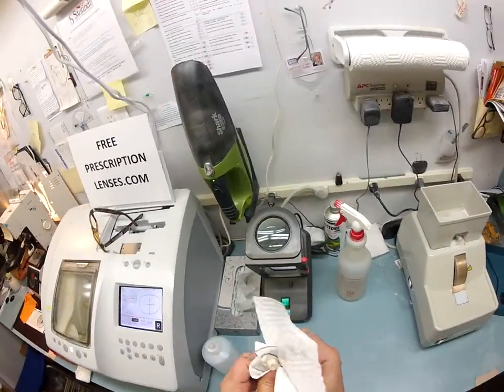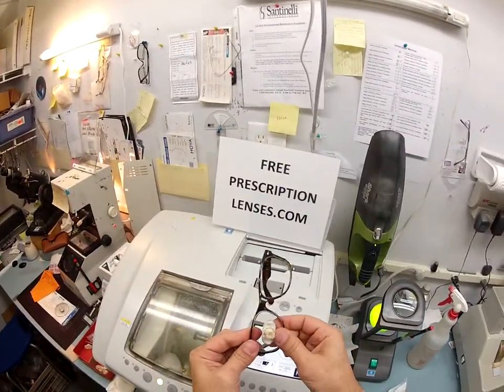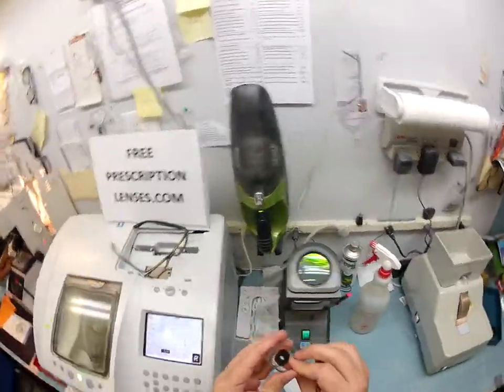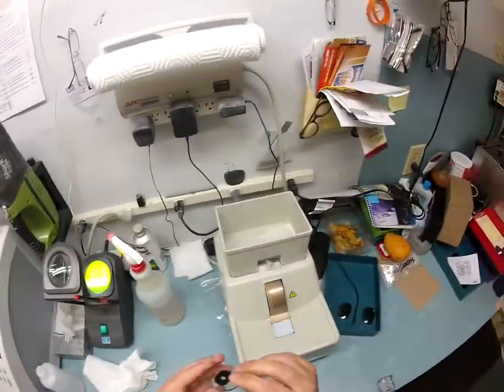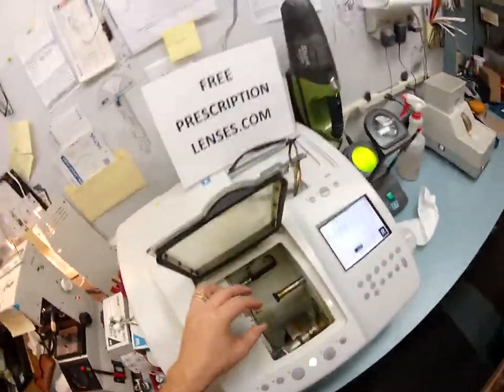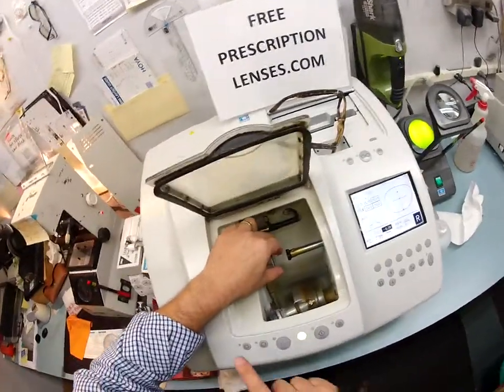So I will be quite shocked if this actually fits, but the first thing I'm going to do is dry your lens off so it's not slippery and I don't drop it on live TV. But to see if it fits, just like before, I tuck it in at the outside corner, press down with my thumbs. No, it does not fit. In fact, I skipped a step, but it's almost a moot point. You still have some rough edges here. I use my hand stone to smooth that out, which I'll do in a minute when I'm not talking and distracting myself. So I'm going to take it down 1/10 of a millimeter and hit the retouch button.